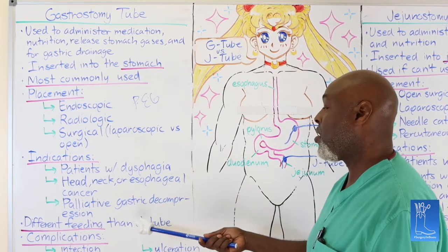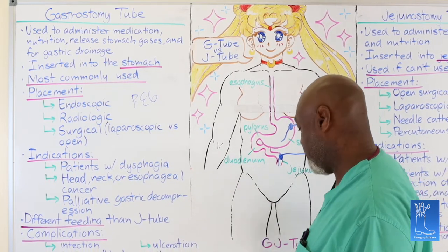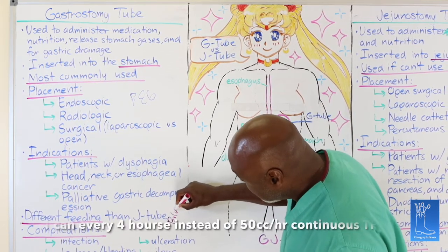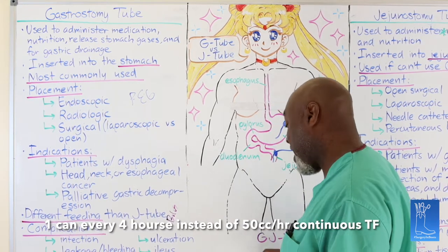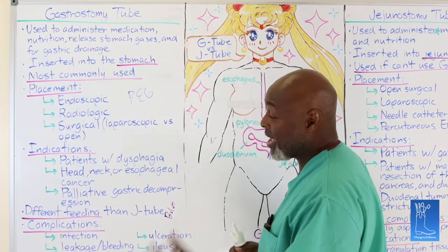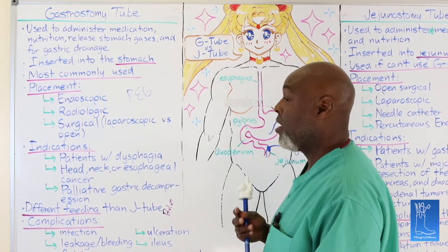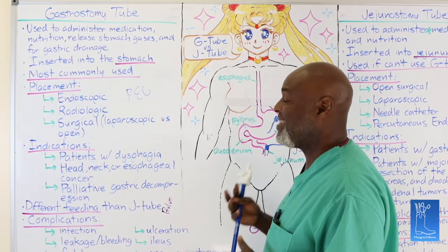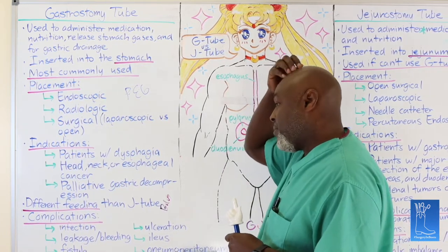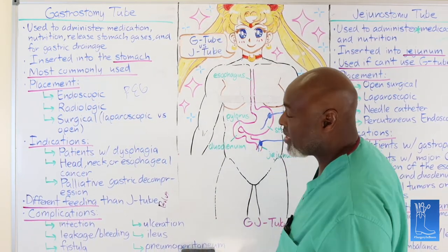These tube feedings are different from J-tube feedings because you can do bolus tube feedings. Bolus tube feedings traditionally just means like it sounds. It's like eating a meal. You put a can in at 8 in the morning, you put two cans in at lunch, you put a can in at 4 o'clock, and you can put a can in at 8 o'clock before you go to bed. So you can get all of those 5 cans in 1 day. You can do it by gravity, which means you don't have to have a fancy pump. You can just hook it up, pour it in, let it drift in, just like eating a meal, and then your stomach takes care of the rest.